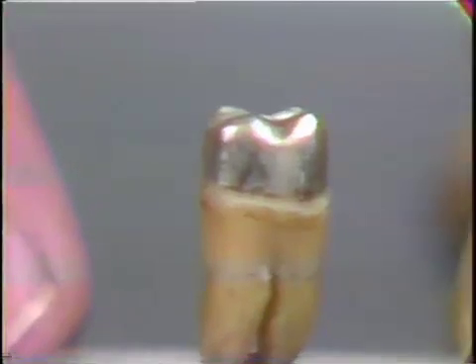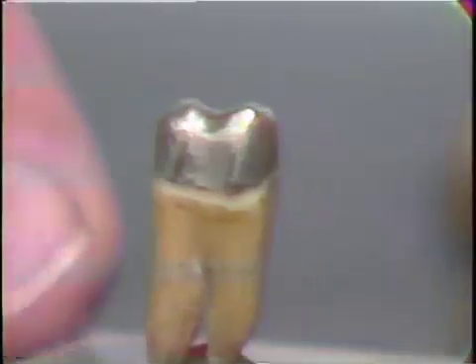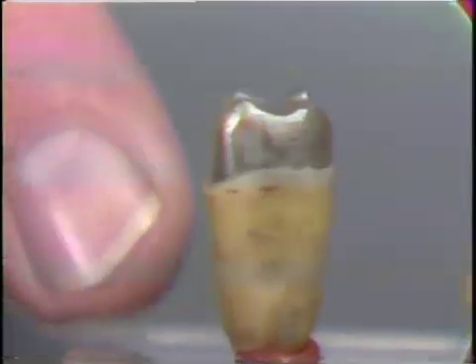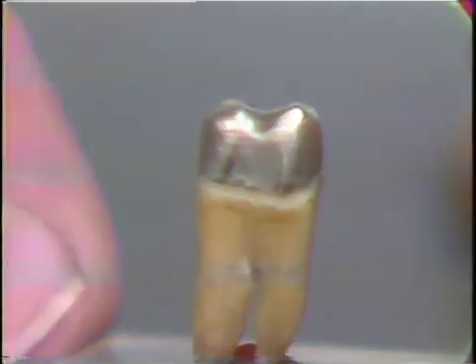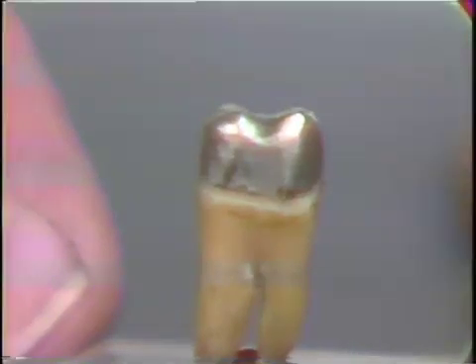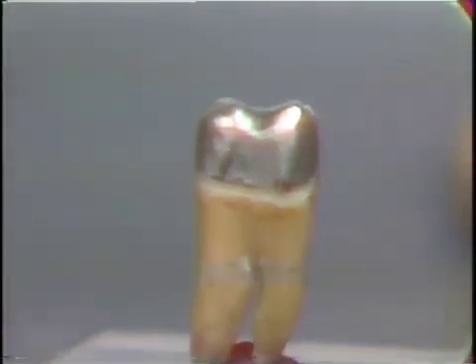later date. If a crown or a bridge which has been cemented on a restoration of this type needs to be removed for any reason, it's a simple matter to remove the crown from the core and leave the core intact. New crowns can be made. Such things can be done to adjust over the years to the recession of gingival margins, exposing the labial cavo-surface angle of the preparation and spoiling aesthetics of a particular case. So here then is the amalgam core retained with pins going into the vital dentine of a molar tooth.